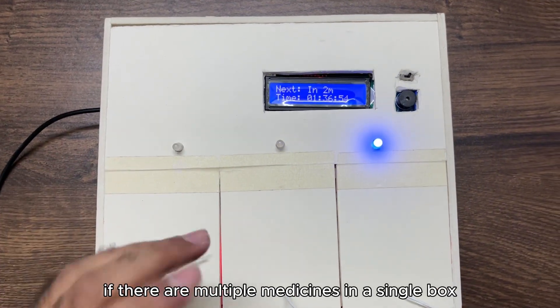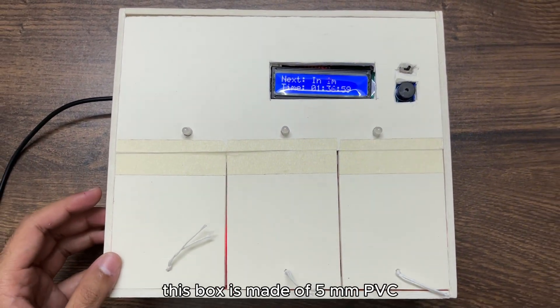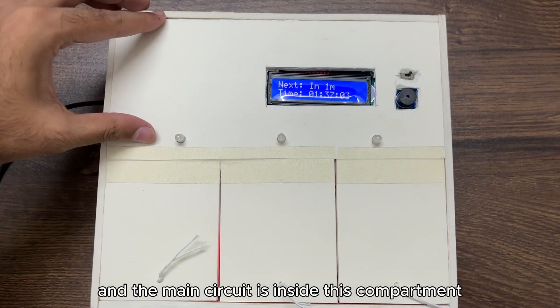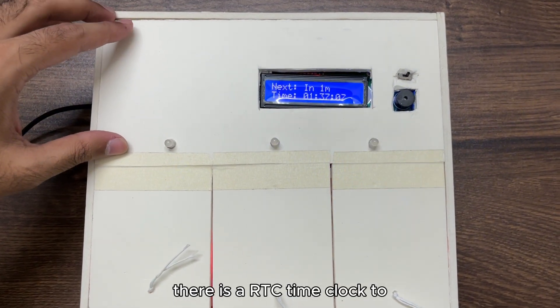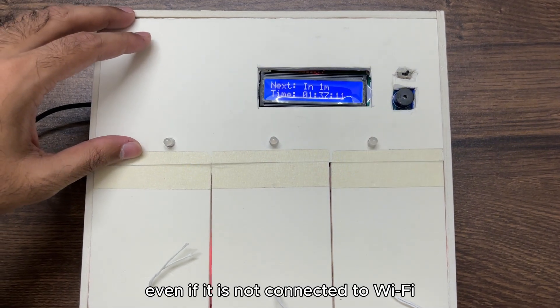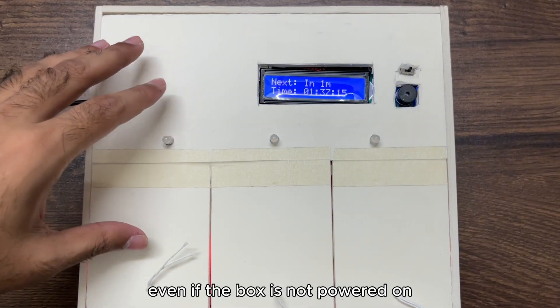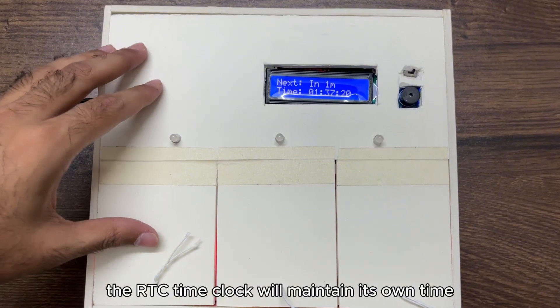This box is made of 5mm PVC and the main circuit is inside this compartment. There is an RTC time clock to maintain the real time clock even if it is not connected to WiFi, even if the box is not powered on. The RTC time clock will maintain its own time.